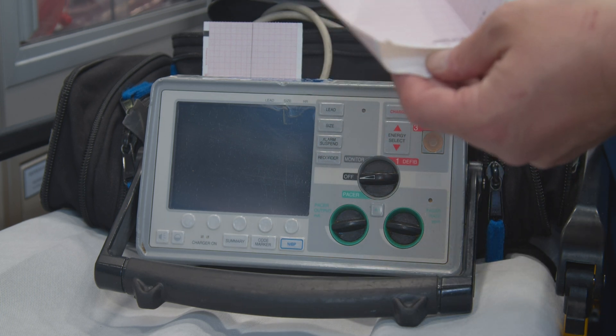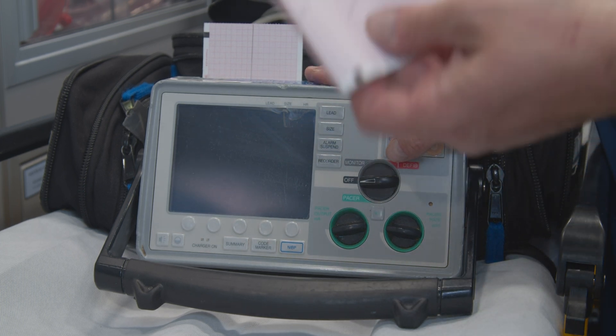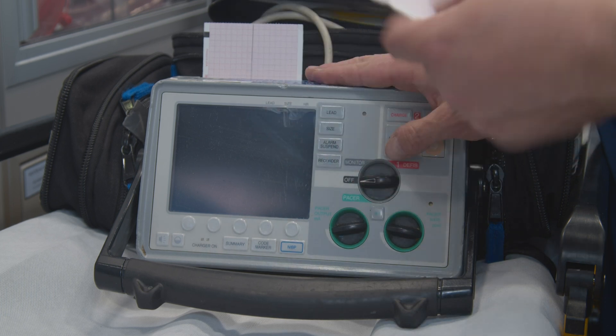This is something that will back up and show that you checked to make sure that the monitor was functioning correctly before taking care of patients. Just hang on to it during your shift. If you don't have any problems, chuck it.